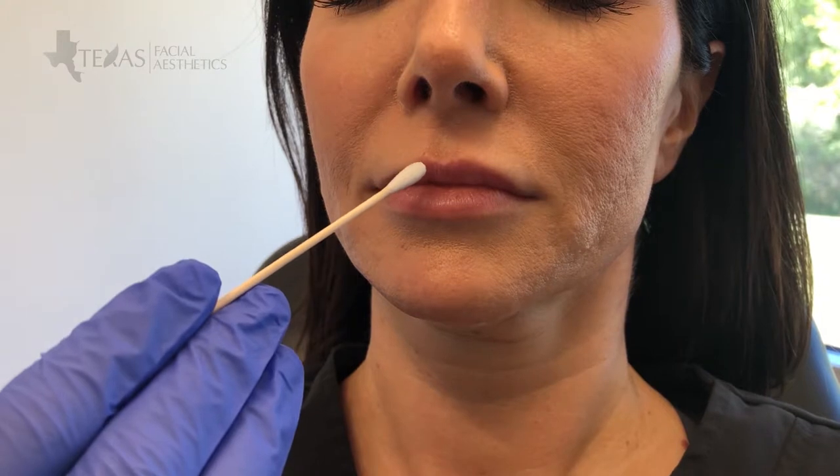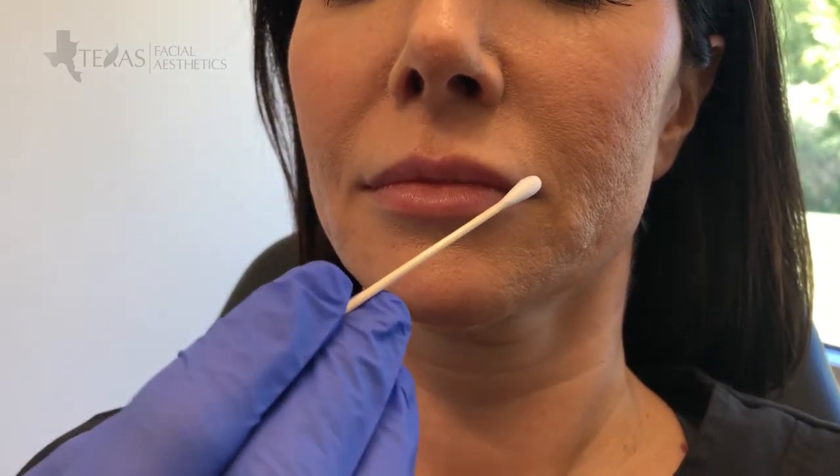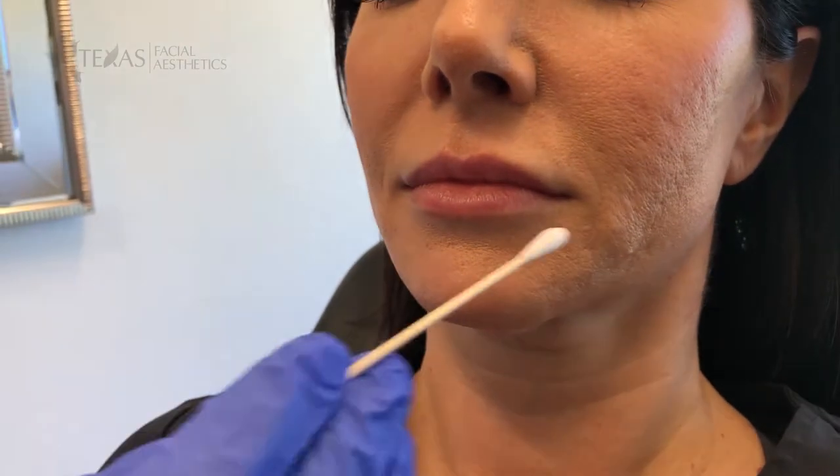We'll add a little bit of volume and a little definition to the cupid's bow there, give the upper lip some volume, but also make sure that we're adding a little volume to the lower lip so that everything remains proportional.